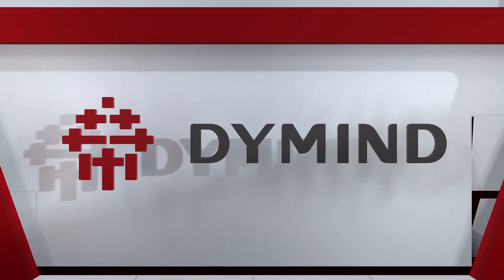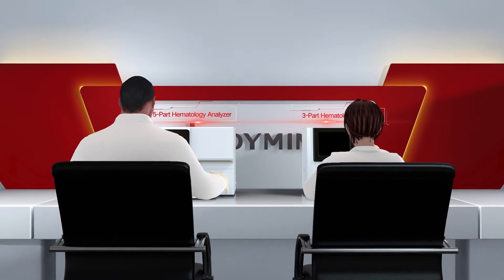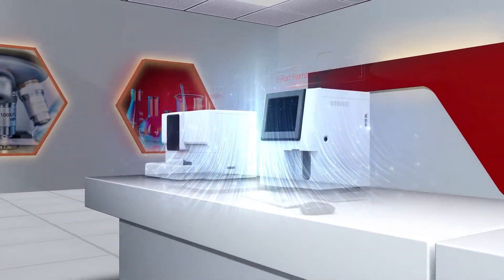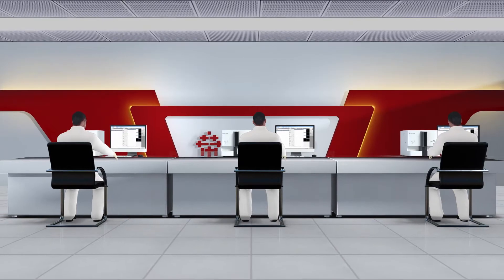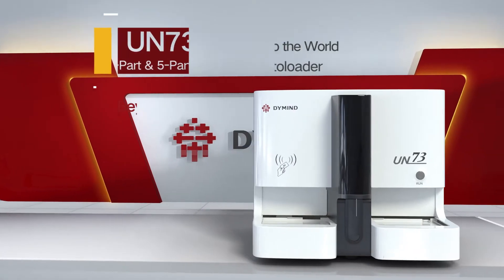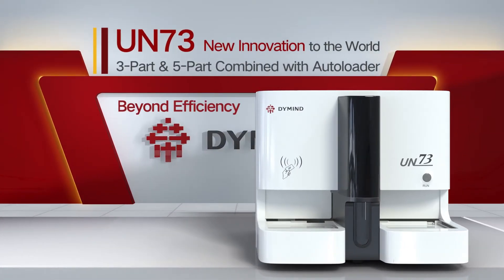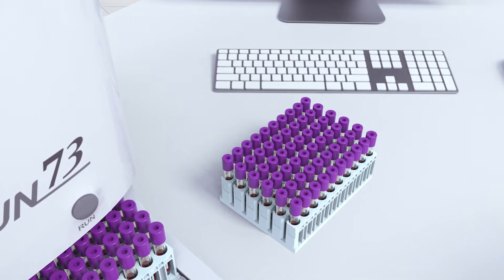With more than seven years of innovative R&D on hematology technology, DMI proudly presents the auto hematology analyzer UN73. This hematology analyzer has three-part and five-part function, combined with auto loader — first launched to the world for sample analysis.